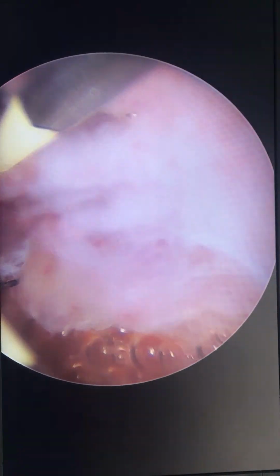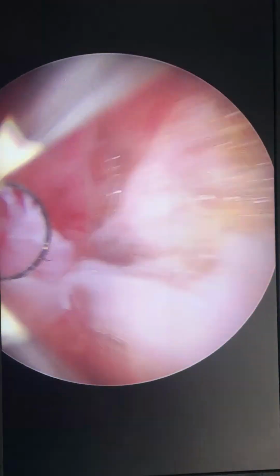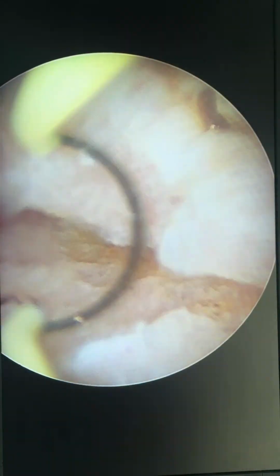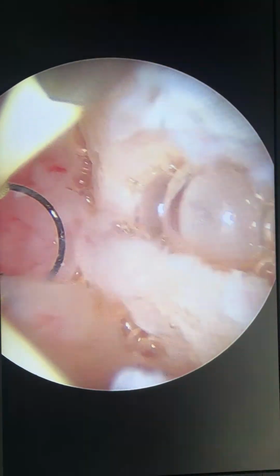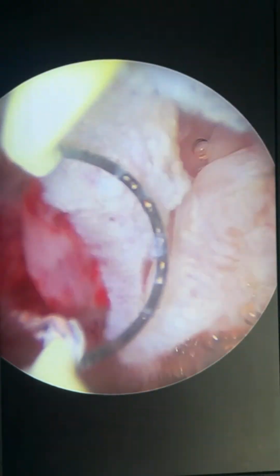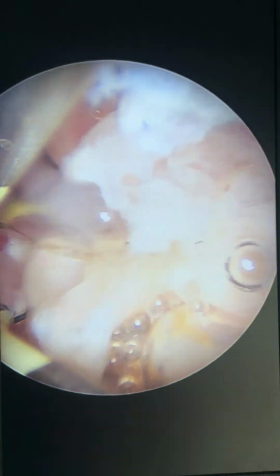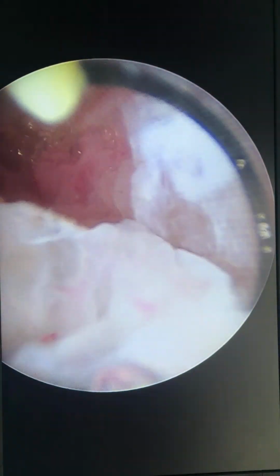The only thing that comes to my mind is that yesterday we had shown a Cesarean scar ectopic. Almost a week back there was another scar ectopic. Such a high incidence of Cesarean scar ectopics really needs introspection among the gynecological and obstetrician fraternity, as to what is giving rise to such high incidence within a week. And there's another one which we are right now trying to bring down.